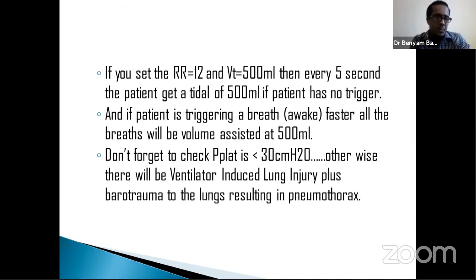So what if the patient triggers? When a patient triggers, he will be assisted to have a 500 mL volume, because it's volume assist control. So volume will be delivered whether the patient triggers, in which case it will be assisted. And if a patient fails to trigger, the set volume will be delivered with the preset time or the respiratory rate per minute.